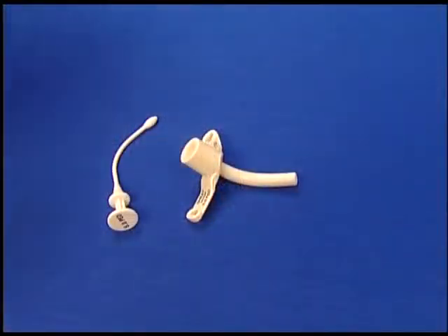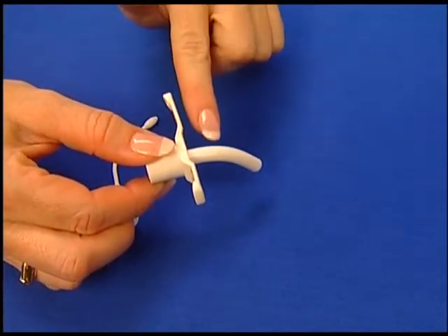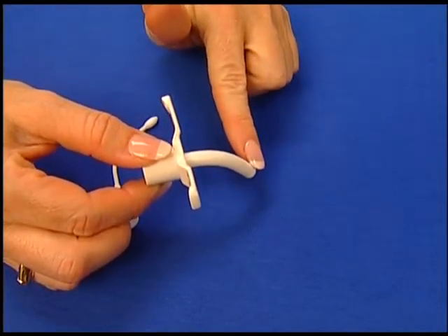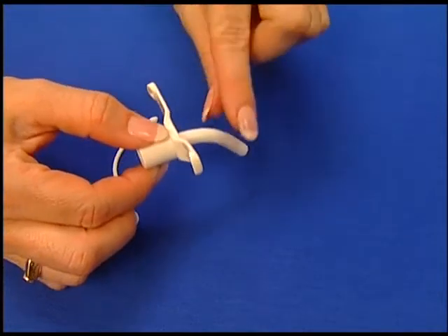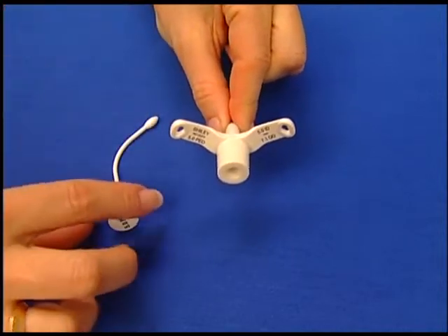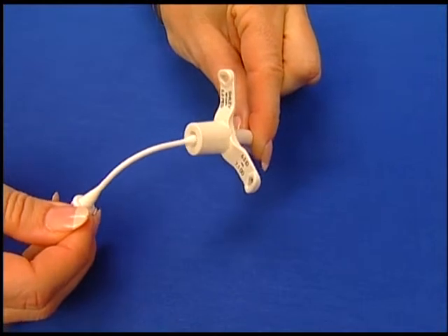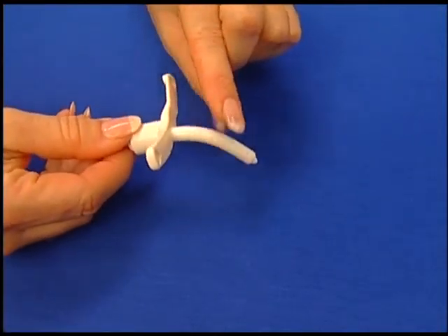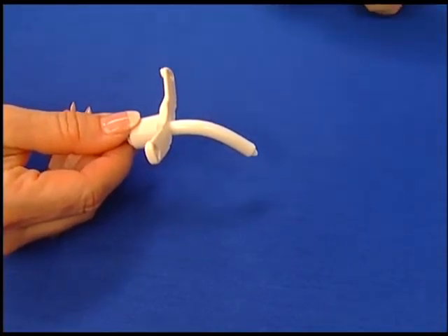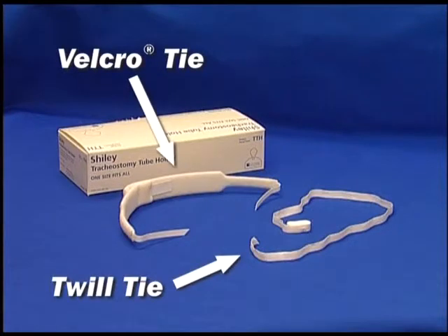Shiley tracheostomy tubes are usually made out of soft, flexible plastic and are curved for comfort. The tube portion of the trach is referred to as the cannula, and the wings on each side are called flanges. All tracheostomy tubes come with an obturator or introducer, which is used to help guide the end of the tube into the stoma or opening of the neck. Once in place, the tracheostomy tube is secured with cloth trach ties that fit snugly against the child's neck.